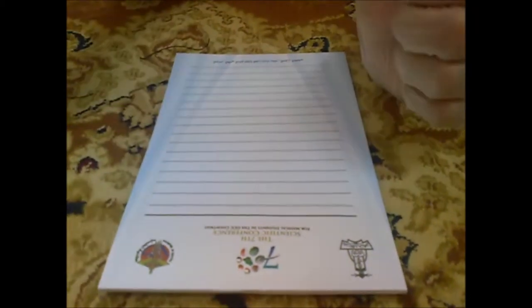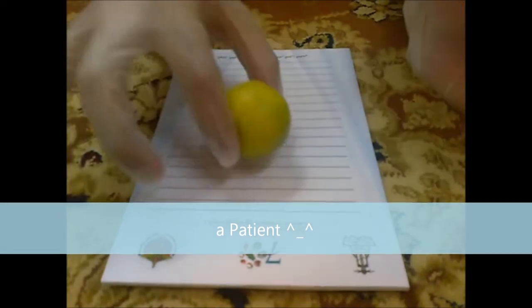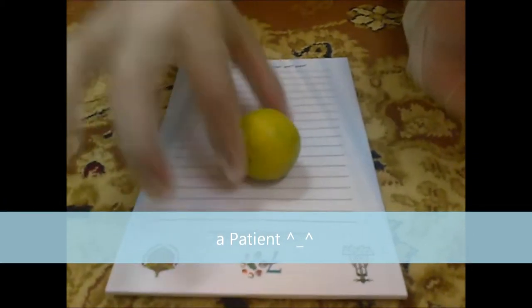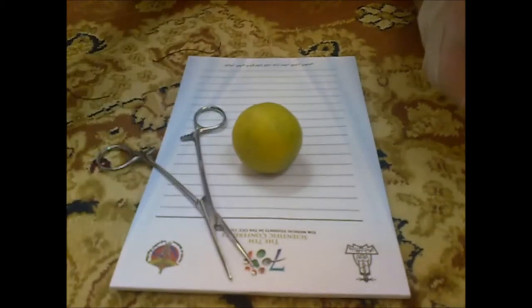Today I am going to do my first surgery. You need a patient. You have to take your mother first. And we need this instrument.